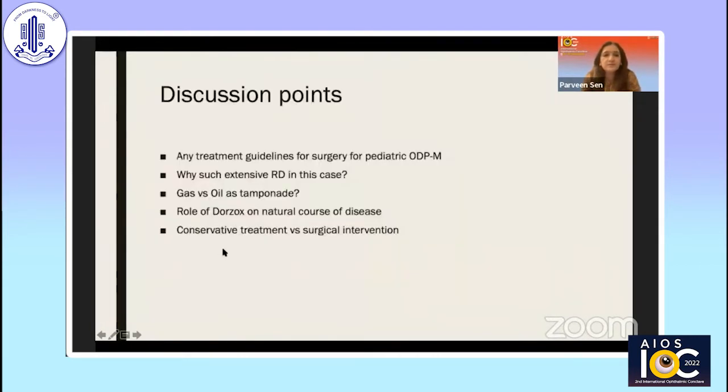macula is also attached. So these are a few discussion points which came to my mind, that how early can you take up these cases? 4 years, do you think it's too young? I did a little bit of literature search. The youngest patient is around 9.